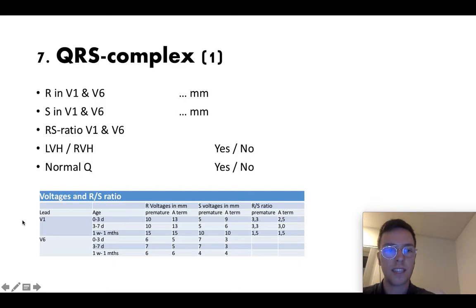Here I added a table with the voltages and the RS ratio. So for example if you're checking R in the lead V1 for a child of one month it should be 15 millimeters and so on.